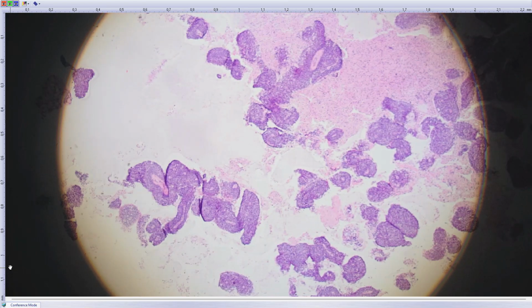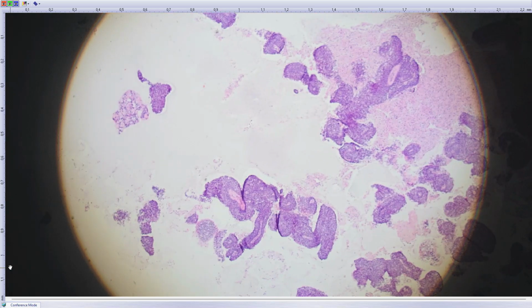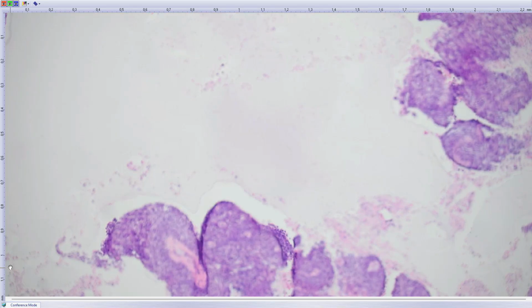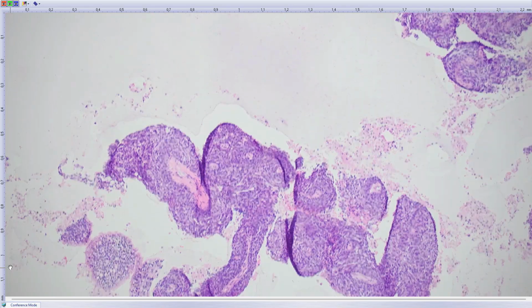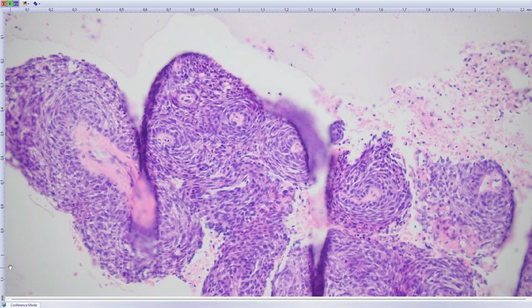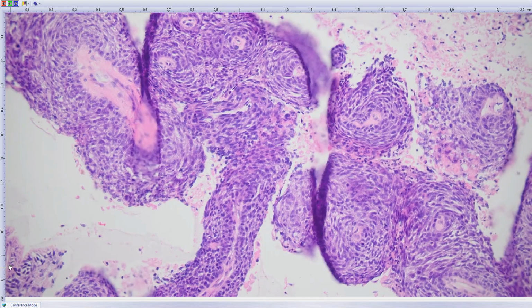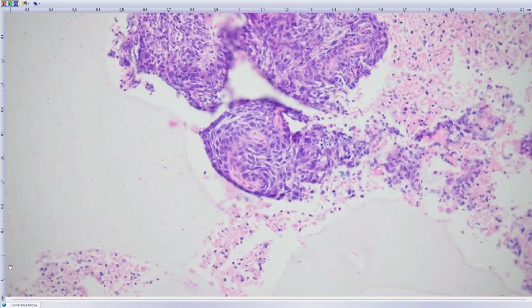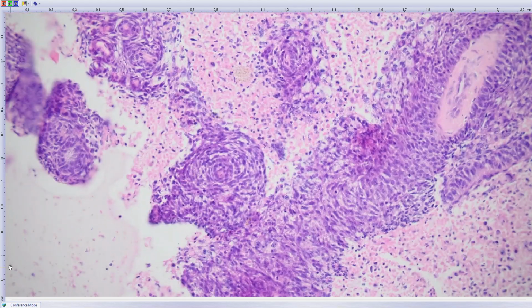And still, just by looking at the biopsy at this very low magnification, it's spindly. It must be melanoma, but it was sent in consultation because melanoma markers were negative. And clinicians sent the case with the diagnosis of probable intraocular astrocytoma.